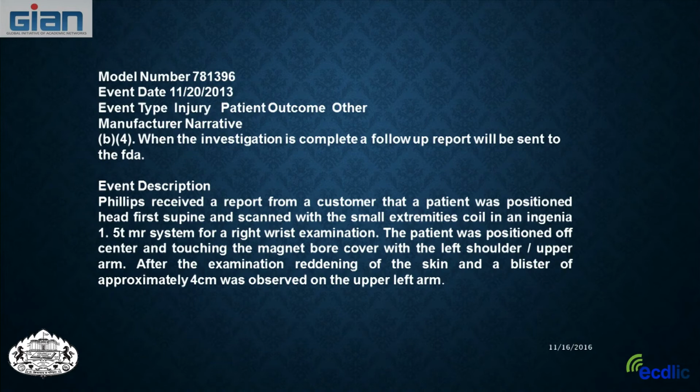Okay, so here's a report where a person was positioned for a supine scan with a small extremity coil. The patient was touching the bore of the magnet with their shoulder, and they ended up receiving a blister and a burn from touching the bore of the magnet. So this is a case where they should have had some padding around them, and they didn't.